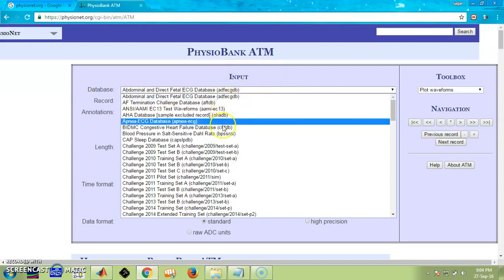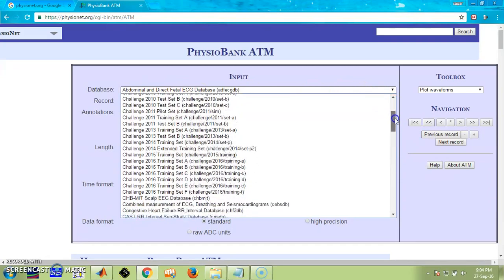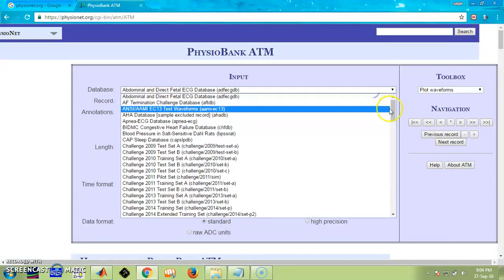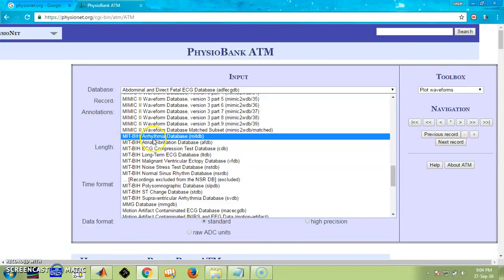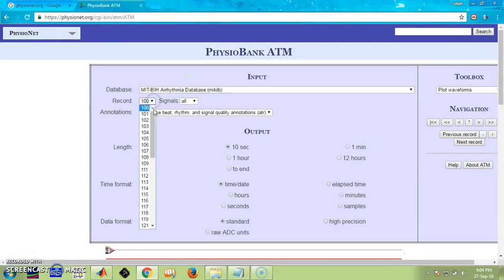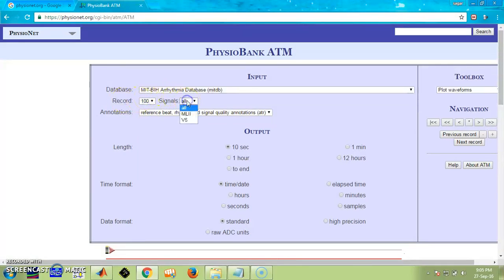Different databases are shown here as well. People who deal with the abdominal database can find it available here. For those who work on different MIT-BIH databases, all the different records up to 234 are available. I am going to show you a record and in that database, these two different signals are available. I am going to plot for the V5 lead.